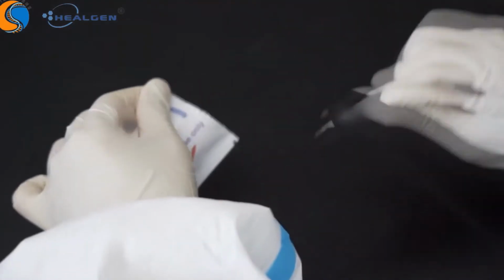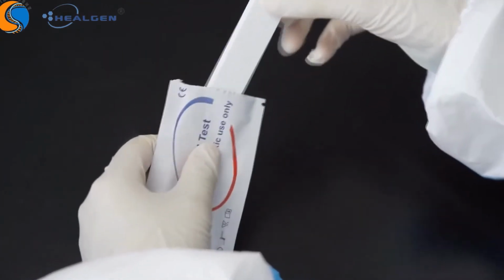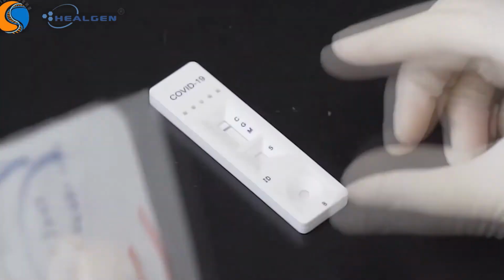Remove the test cassette from the sealed foil pouch. Do not open the pouch unless you are ready to begin the test. Place the test cassette on a dry, flat surface.